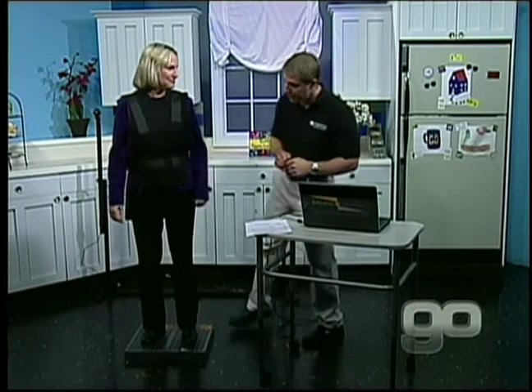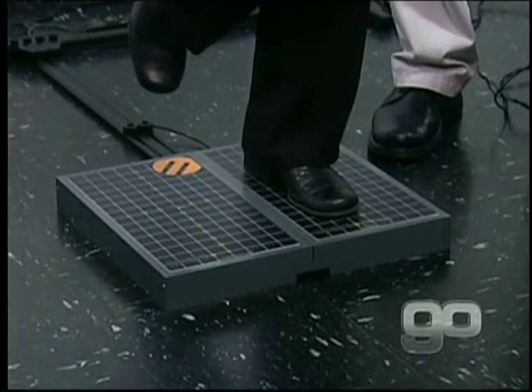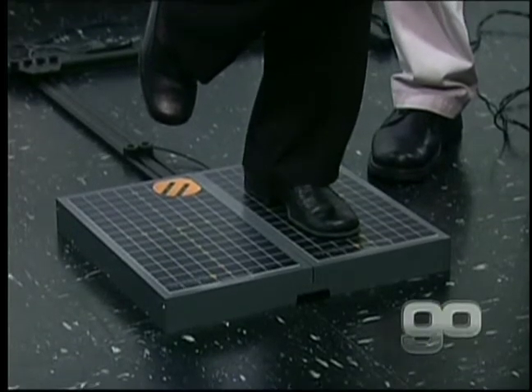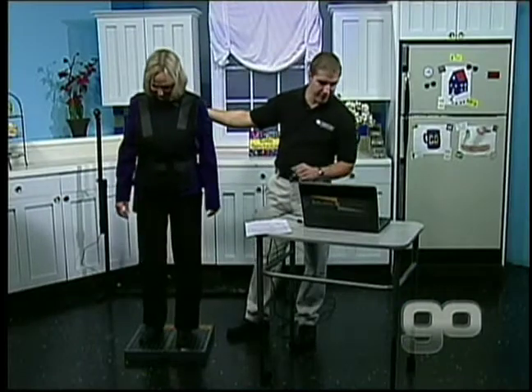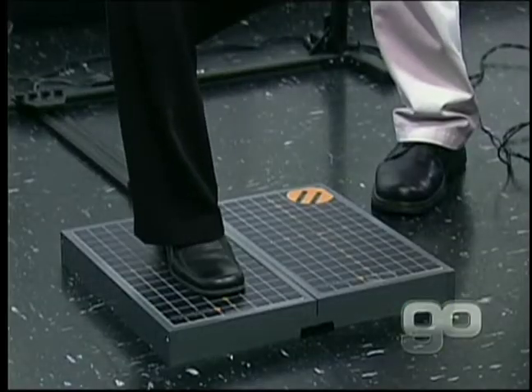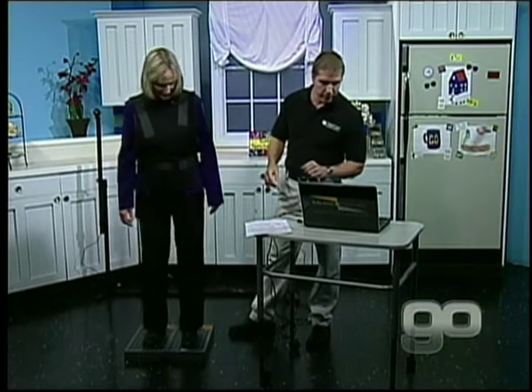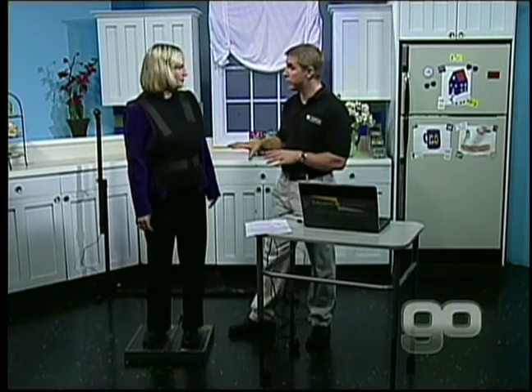Now what I'd like you to do is go ahead and stand on your left foot. I'll stand close just in case you lose your balance. And hold that position for 5, 4, 3, 2, 1, and relax. Excellent. How did it feel? Okay. Not too bad. Let's try the right leg now. Okay. And 5, 4, 3, 2, 1, and relax. Very good. Now 2 more tests and we're done with your assessment.